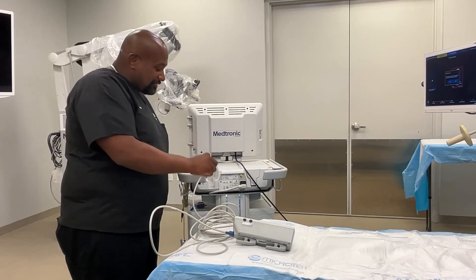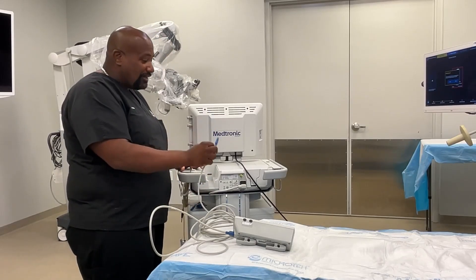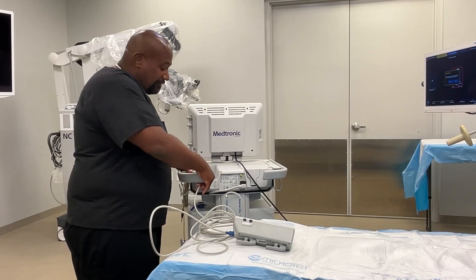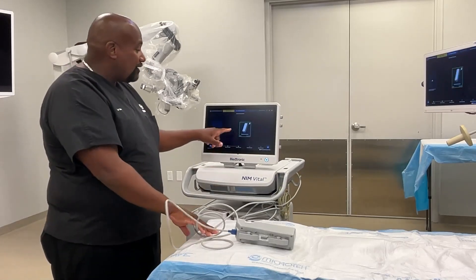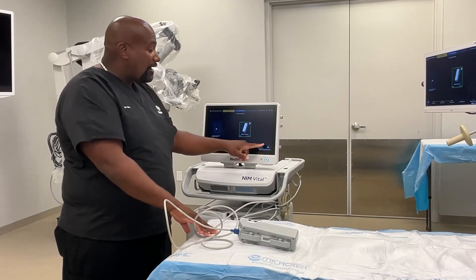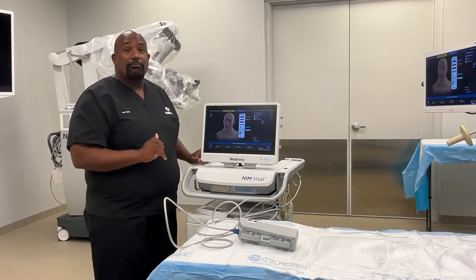The other end of the cable gets plugged into the back side of the NIM. It has the blue section and the blue end of the cord just gets plugged into the end of the NIM VITAL like this. Once it's connected, the NIM VITAL will automatically tell you that it's wired. So instead of having a Bluetooth symbol, it'll show the wired symbol and then you can proceed with your case.